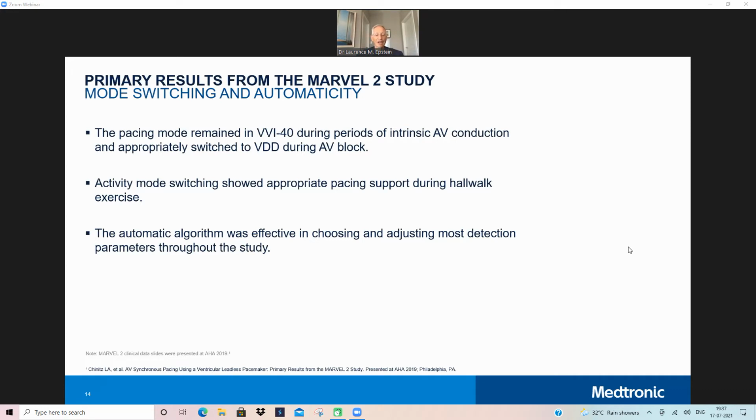A lot of our Medtronic team has become very expert in making some very quick adjustments at the time of implant. There are some patients we have to bring back and further tweak and adjust. But overall, the automatic detection is good. I know that in the next iteration, Medtronic is working very aggressively to perfect the algorithms to make it much more out-of-the-box friendly for those of us who implant these devices.